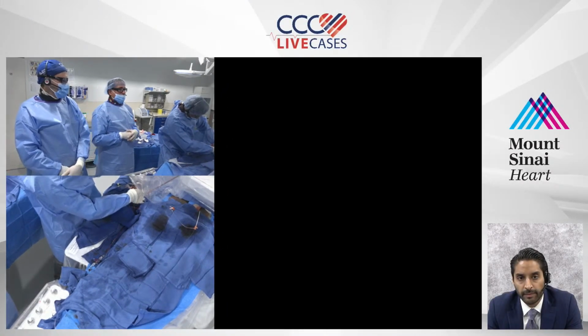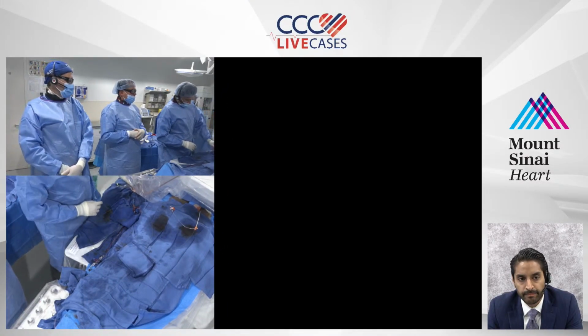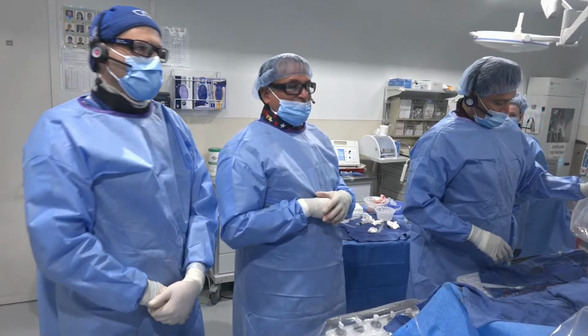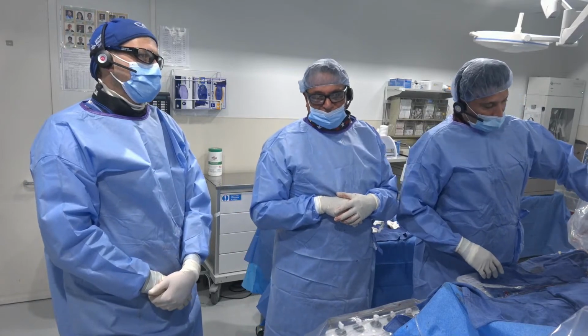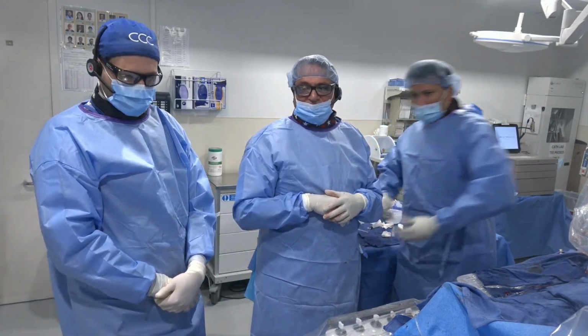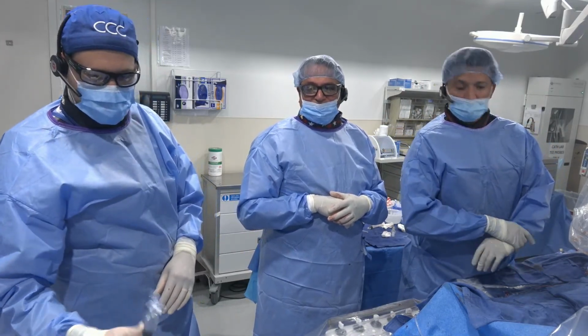We should be fine, because I think it's like one of those things, right? Either you're going to decide and go with bilateral access. I'm a little concerned after having as much trouble as we did with the arch, and I remember Luke and I struggled a lot doing the intervention of the other iliac. So I think that getting a sheath up there will be very, very difficult.